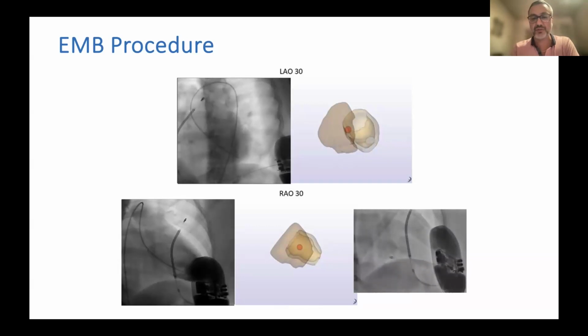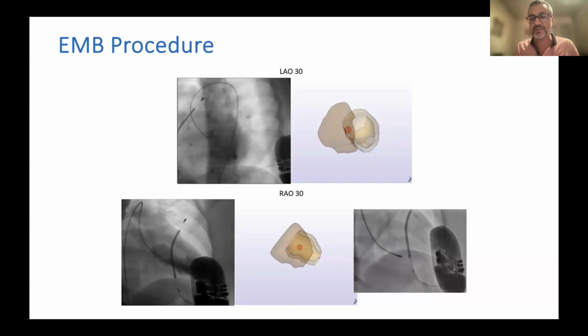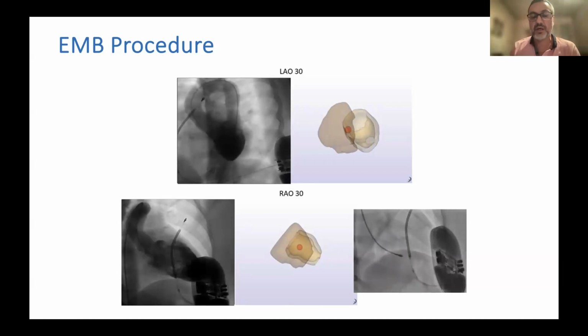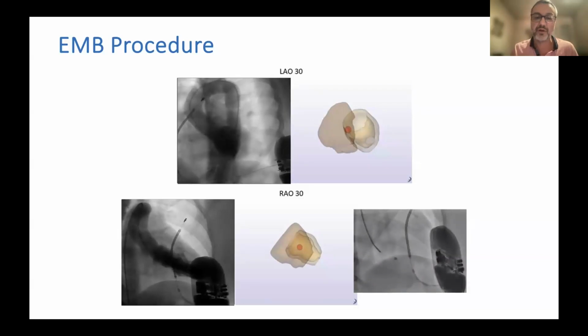For this patient, because the late gadolinium enhancement is transmural in a septal view, you decide to use a simple right access, but for the good orientation, you decide to perform a ventriculography by femoral access. And finally, you perform the biopsy.